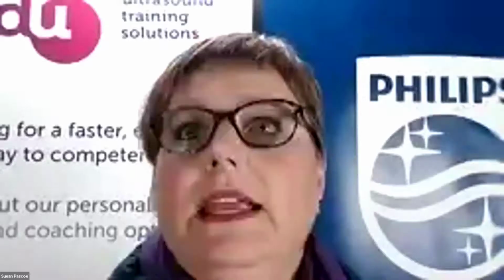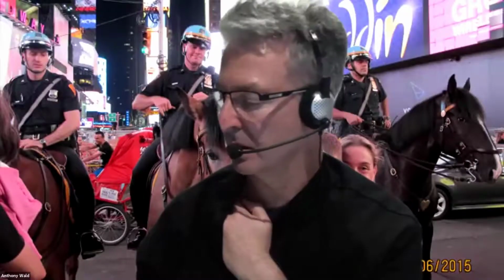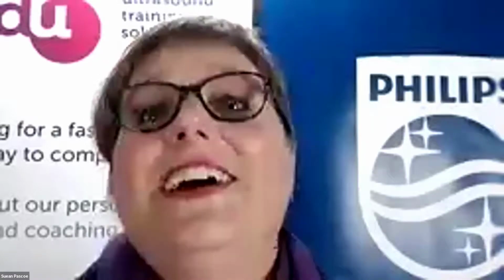Does anyone else have any tips they'd like to share or comments to make or questions on that one? So I think Euan, can you hear me, Euan? Yeah, I can. Thanks, Anthony.